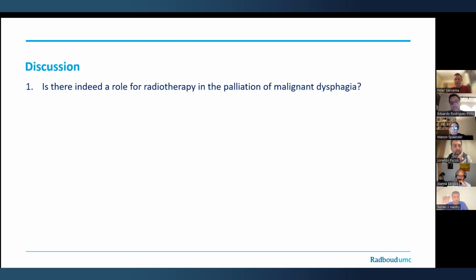Maybe we should go to the Q&A box, and maybe I have a question for Manon. Manon, when do you need to use fully covered stents and when partially covered stents? Thank you, Peter. Thank you, everybody, and thank you for this interesting question. As Peter has shown from the retrospective study we performed in more than 1,000 patients, you saw that migration was mainly due to the fully covered stent.